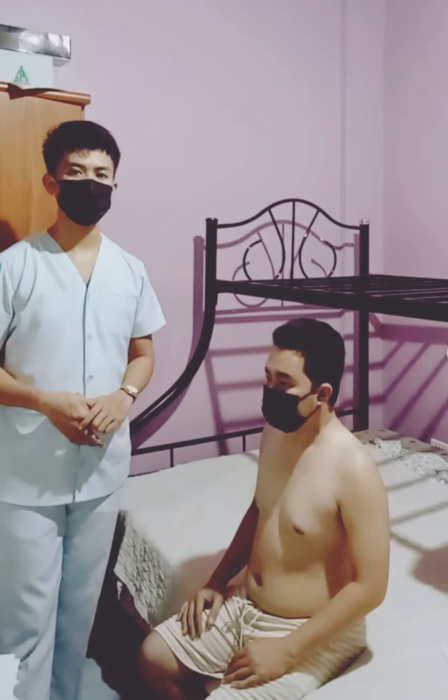Next I'm going to auscultate the anterior chest using the sequence I used in percussion. Inhale, sir. Exhale. Inhale. Okay, that's good. After that, document the findings in the client record.